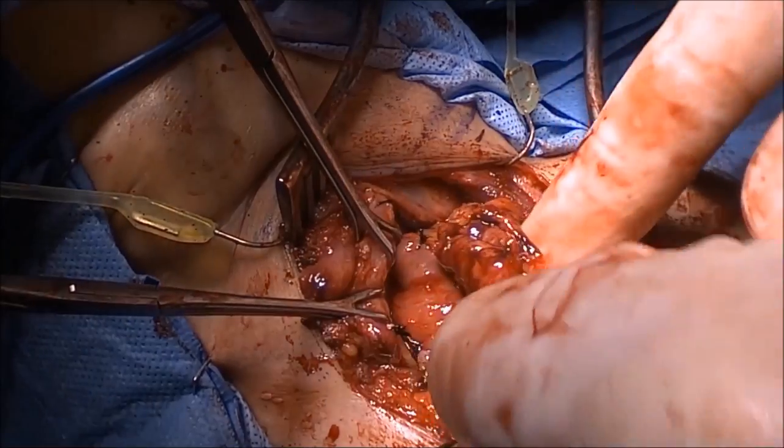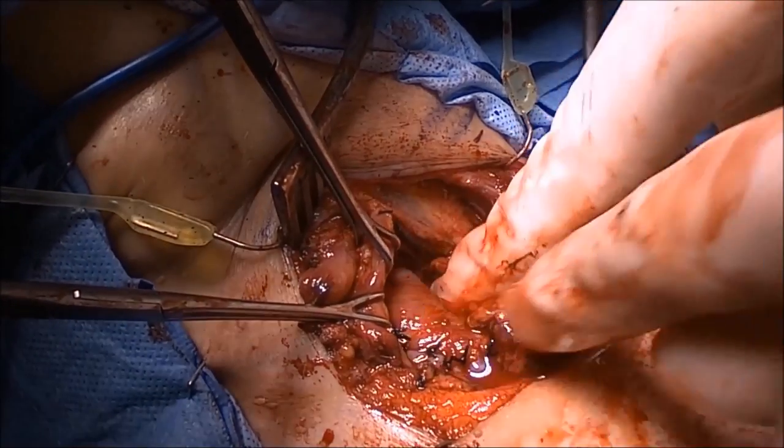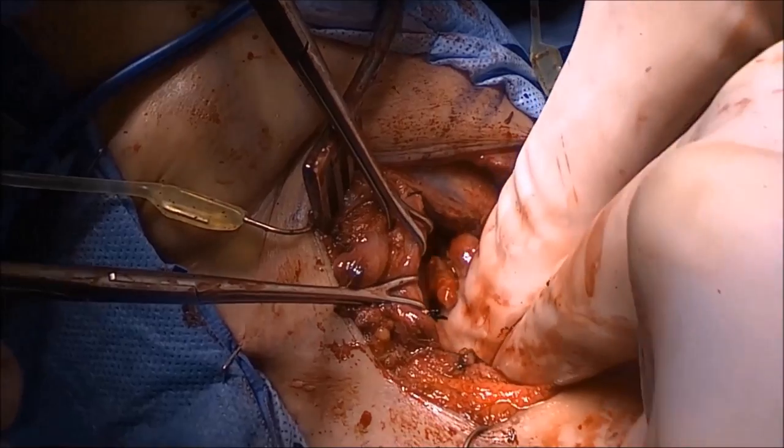An outer row of 3-0 silk sutures is placed in a Lembert fashion. The incision is then closed with 3-0 Vicryl, 4-0 Monocryl, and skin glue.